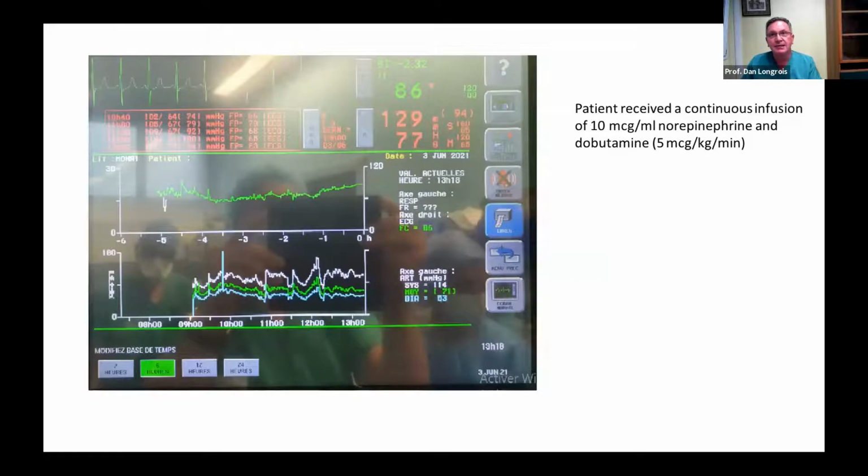And the second issue is that the way the NOL was designed is that the amplitude of changes is much more important when you have an imbalance between nociception and anti-nociception, and in this respect, the amplitude of the changes in heart rate is much lower. So in this respect, the NOL is much more sensitive. The blood pressure is confounded by many issues.